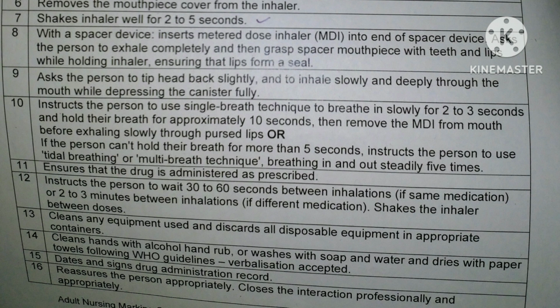If they are unable to hold the breath for more than 5 seconds, instruct the person to use the tidal breathing technique, that is breathing in and out steadily 5 times. They have to make a tight seal, everything the same, and then breathe in and out steadily 5 times. That is the difference.